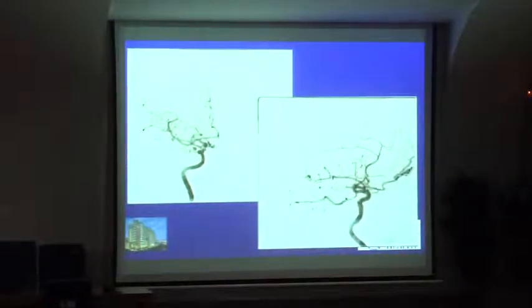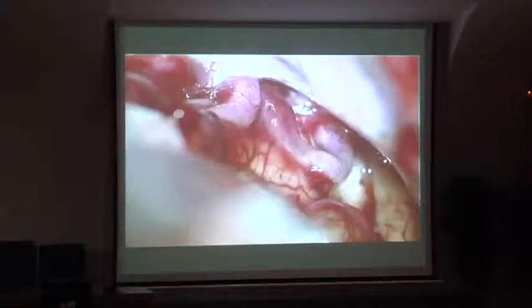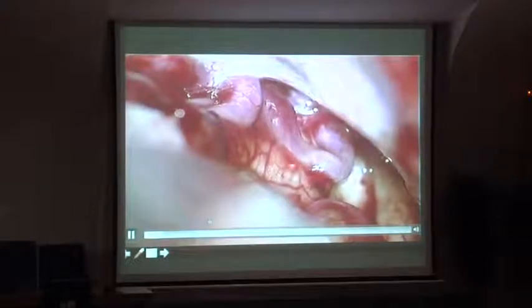And then the next patient, I lost vision in the eye. I was far distal from the central retinal artery with a nice blush, embolized, and the patient thrombosed the whole ophthalmic artery and lost vision in that eye. So I think you have to think about these things before you decide what you do.